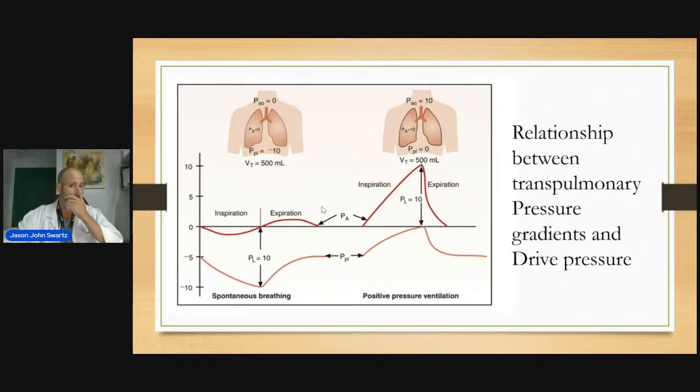When things start going wrong, and we have patients in the ICU, and now we have to take charge, things will get tricky because on expiration, if we don't have a proper PEEP setting and the pleural pressure on expiration is greater than the alveolar, you are risking atelectasis, just basic physics.